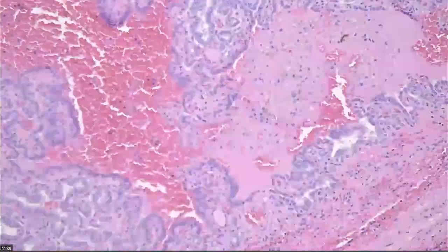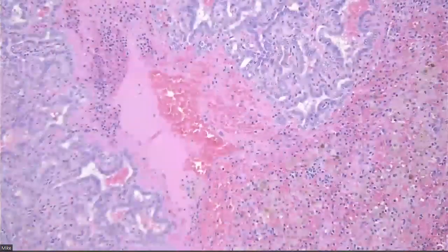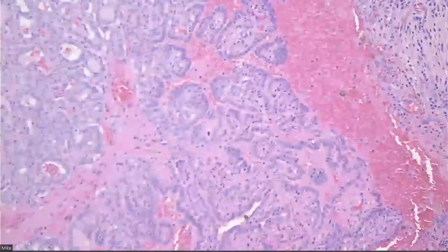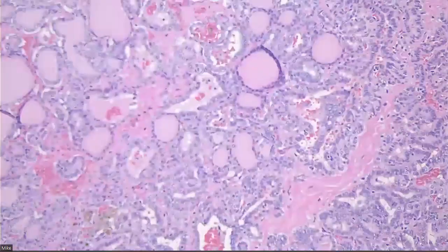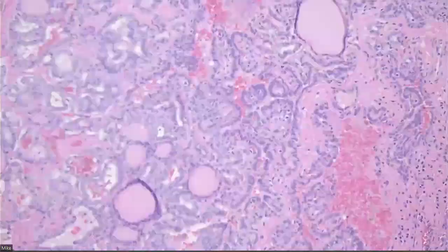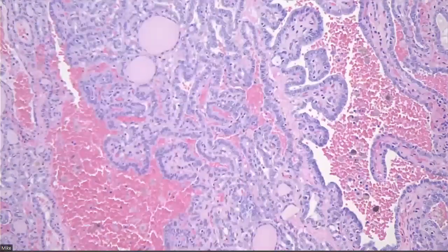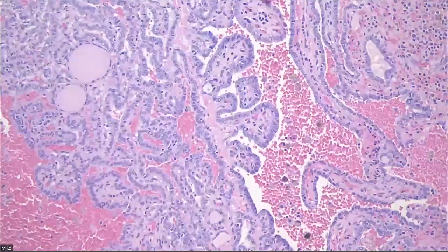So this was in the time where I didn't know what to do. I think I called this a mostly follicular pattern neoplasm with some papillary structures and some nuclear atypia. Probably a NIFT-P, but I don't know why there's all these papillae. So then I did molecular, because the BRAF V600E stain was negative. Always start with that. But I was worried enough that I sent this for molecular, and that's the good thing we have here, that we can do that.